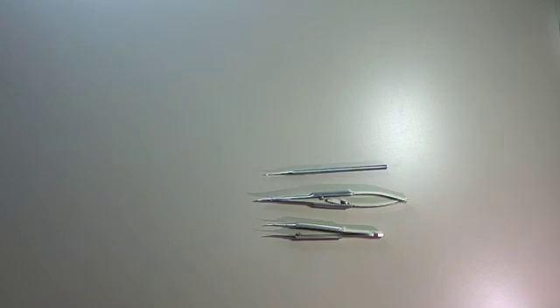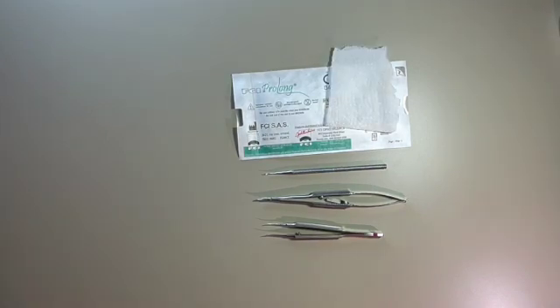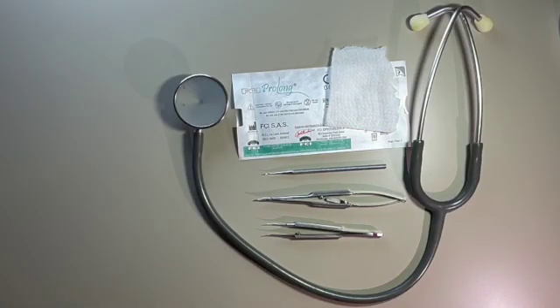Then you need the punctal dilator. This is used to enter the punctum and widen it to place the plug inside. After that, you need the punctal plugs. The one used for the demonstration is the temporary collagen punctal plug. A small paper towel is used to clean off the anesthetic drop when it drips. And most importantly, you need a specialist eye doctor.